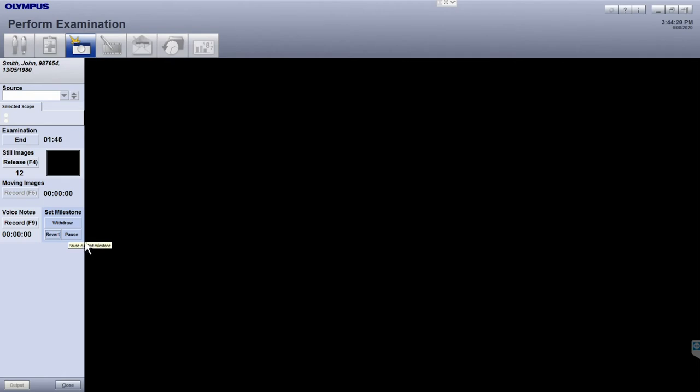The Pause button allows you to pause the calculation of the milestone duration. For example, if you found a polyp or would like to perform any other intervention, so it doesn't affect the milestone duration calculation.